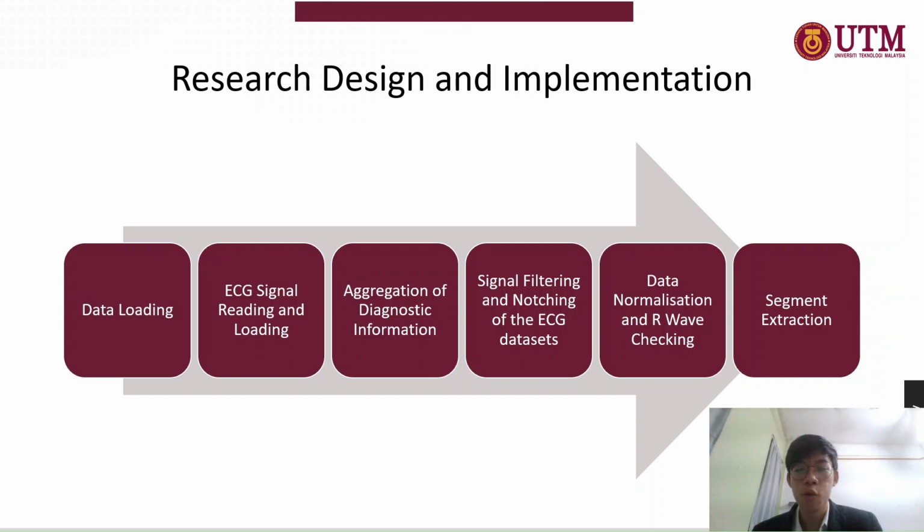First will be data loading, ECG signal reading and loading, continuing with aggregation of diagnostic information, and the next will be signal filtering and notching of the ECG datasets. Next will be data normalization and R-wave checking. And last but not least will be segment extraction.